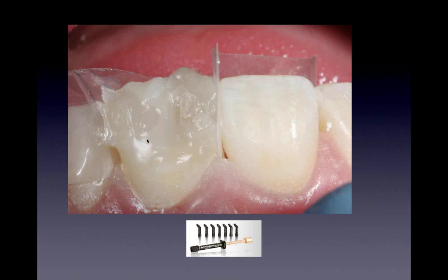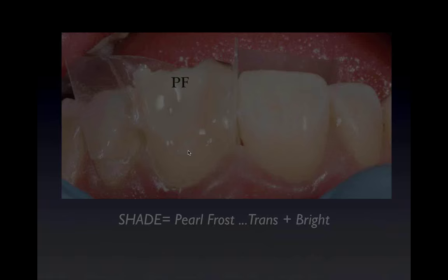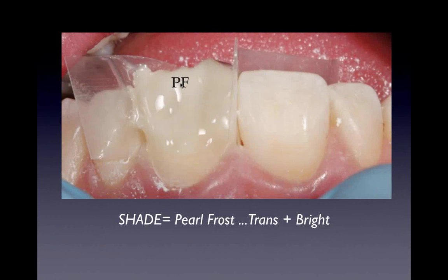So we're building up. You see a different little color here of A1 and A2 here. A little bit of flowable on the outside, so we really get some compression. So that's the A2 and that's the A1. And remember, those are going to come lighter. The A2 is going to turn into A1, the A1 is going to turn into a B1. So they're always going to turn a little bit lighter than what we want. And here's a little bit of the pearl frost, which brings out the trans and a little bit of brightness in it. But you see I'm overbuilding, and I'm going to contour down.